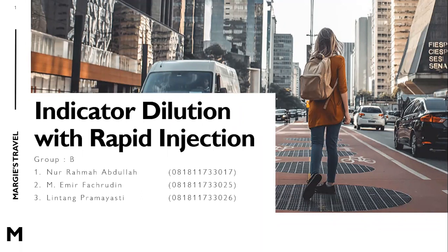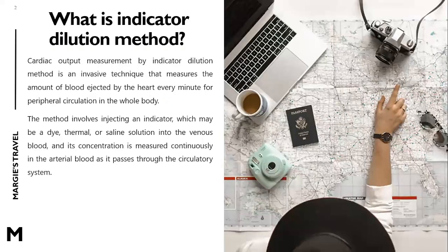Today, we'd like to tell you about indicator dilution with rapid injection. So, what is the indicator dilution method?